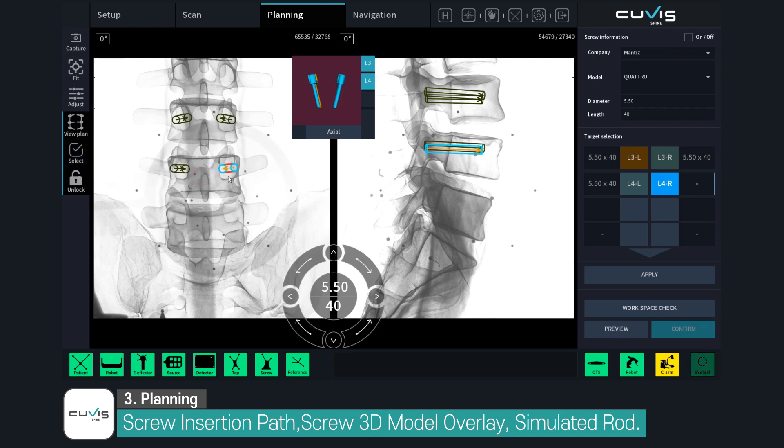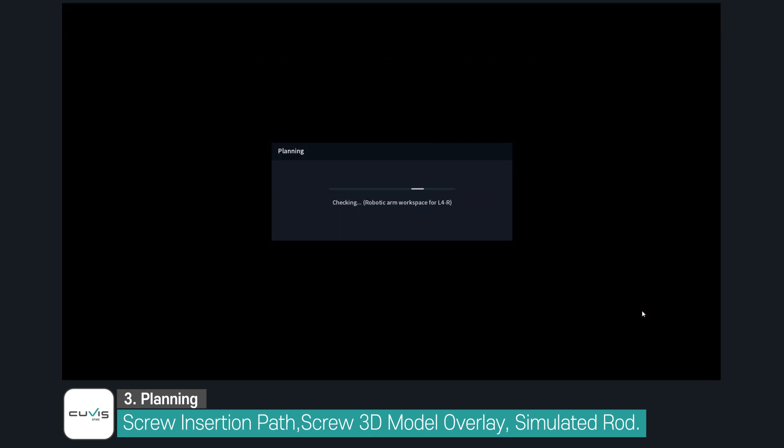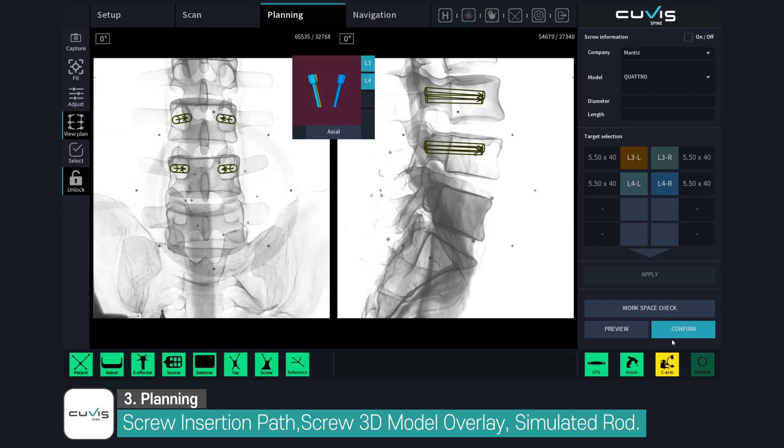When the surgical planning is completed, the system checks if the robot can guide the surgical instrument or not. The preview allows you to see all the planned screw paths.